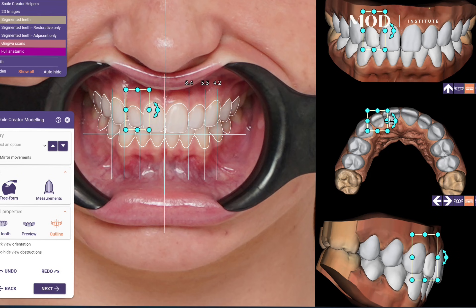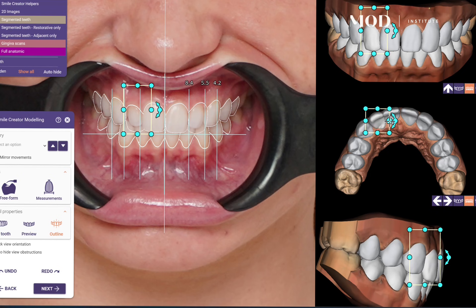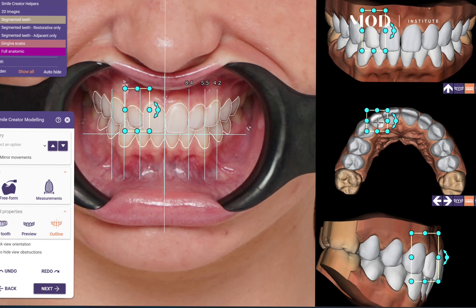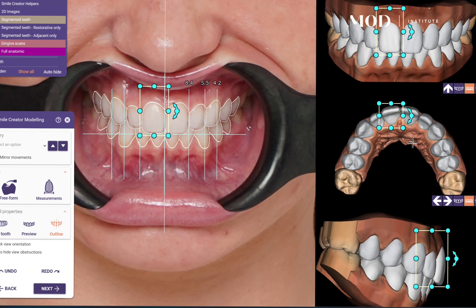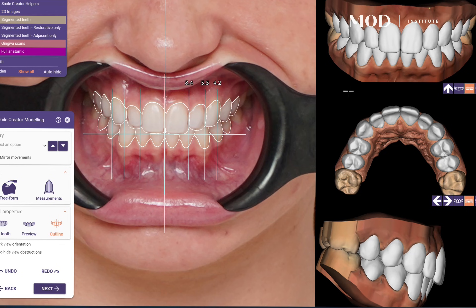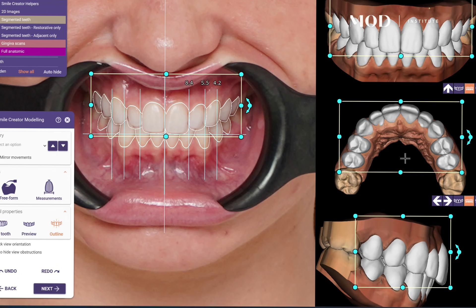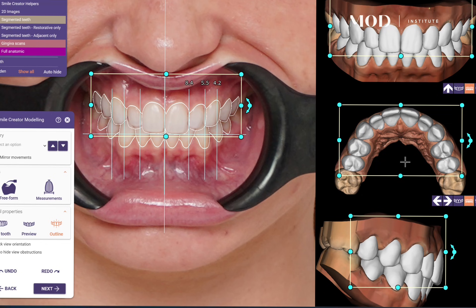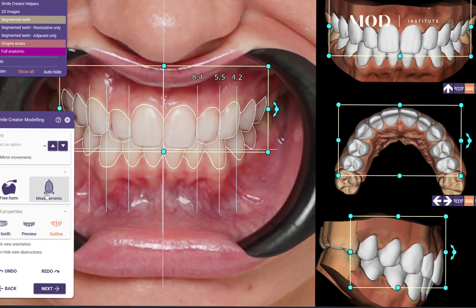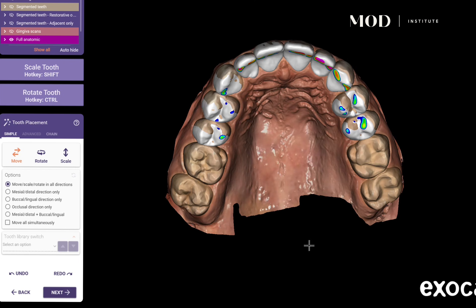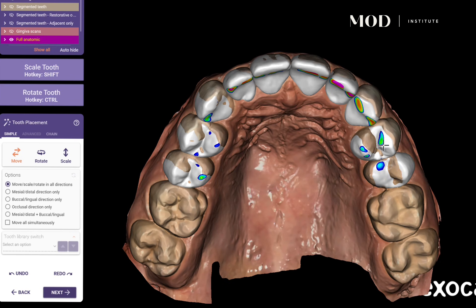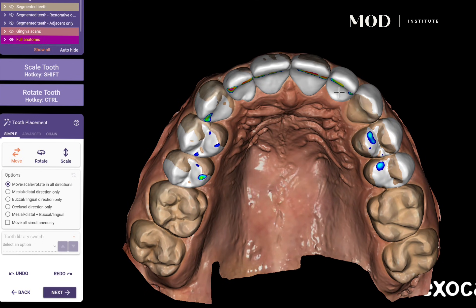I'm hitting the mirror image button so that when I stretch tooth number seven, tooth number ten will be manipulated the same way — with eight and nine as well — so every tooth mirrors my movements. Now I'm making sure I have my anterior-posterior position right and my midline where I want it, measuring my front tooth at 10.7 millimeters, which is ideal for this patient.